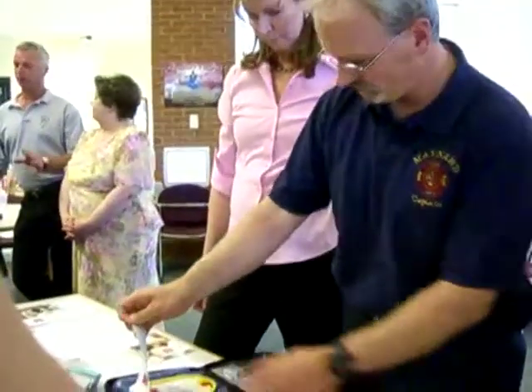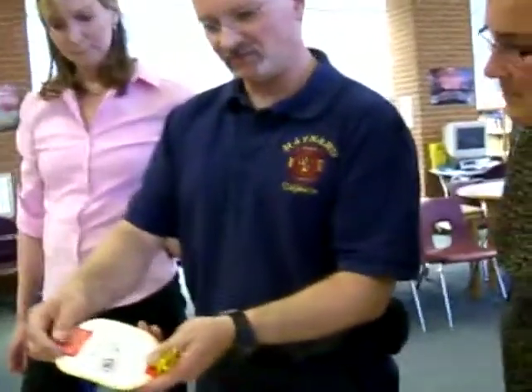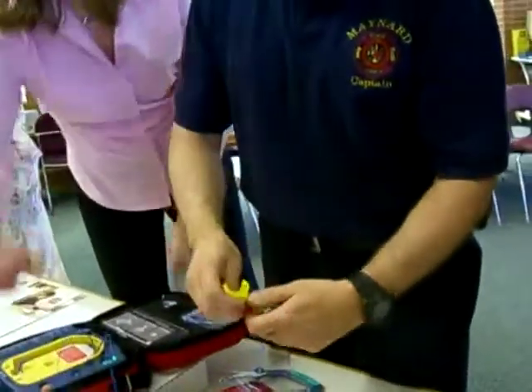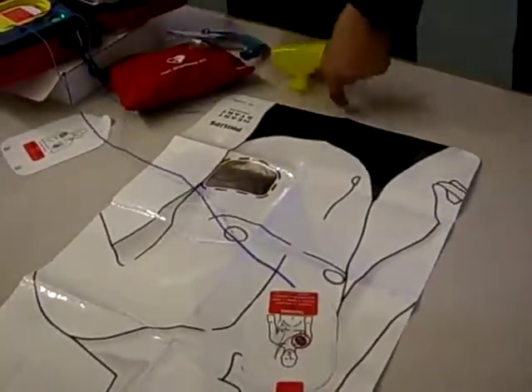Cut clothing if needed. Look carefully at the pictures on the white — right there, even on the pads. It shows exactly where they're going. Remove the yellow plastic liner. Place the pad exactly as shown in the picture.